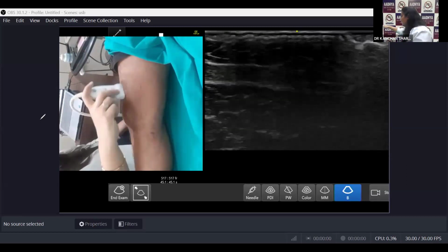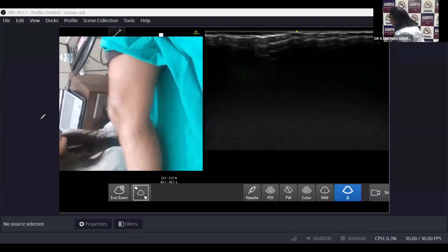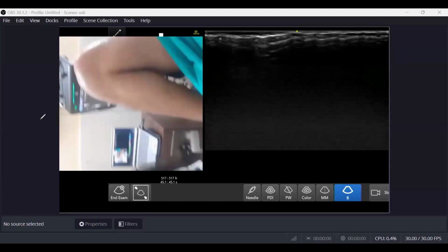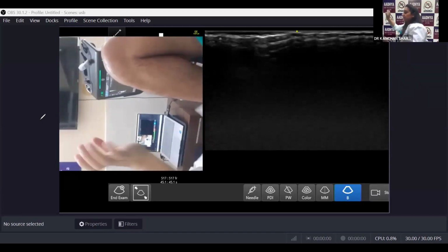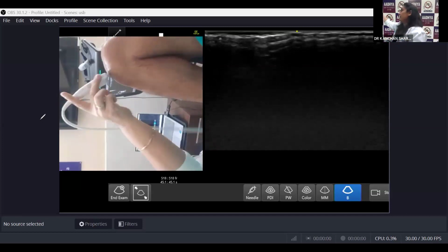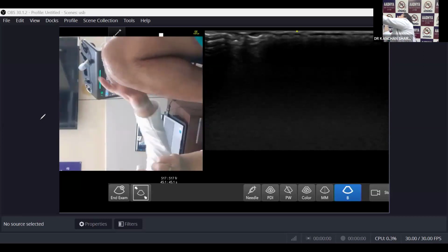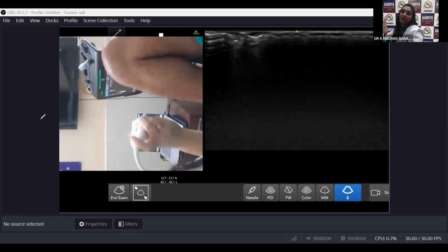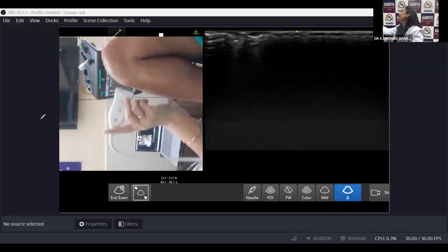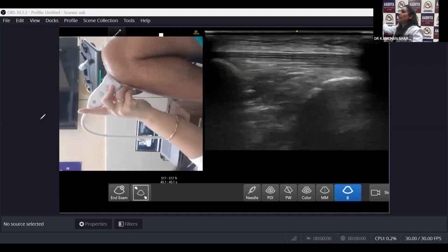The second thing is the trochlear cartilage, which I forgot to show you. For that, you need 90 degrees of knee flexion. Okay. So if that is the 90 degrees of flexion, you just put your probe. If, with flexion, you really don't know where your patella has gone, I will tell you a nice way. Everybody by this time knows where the patella is.